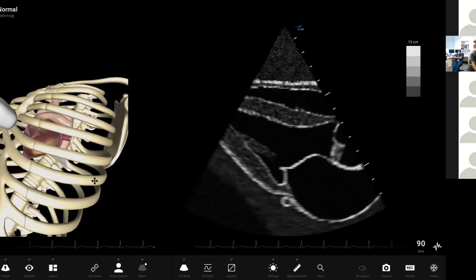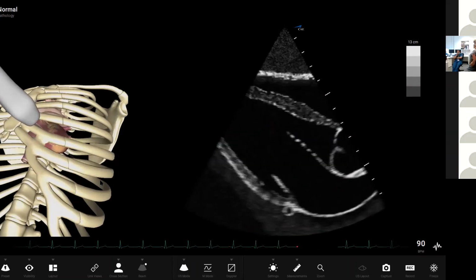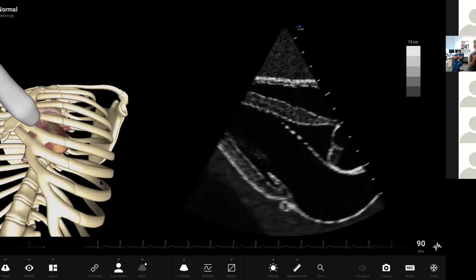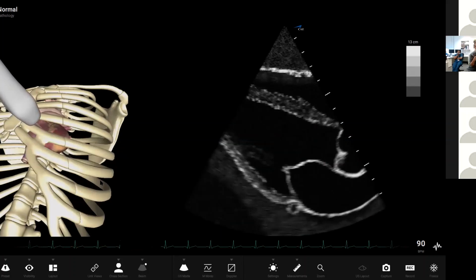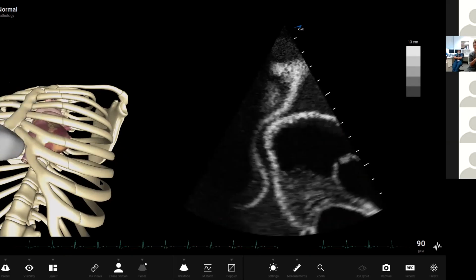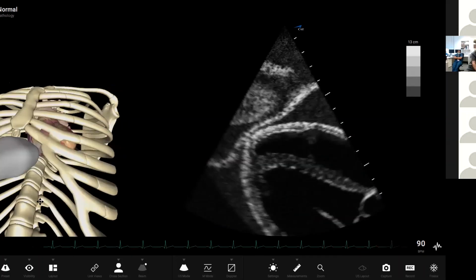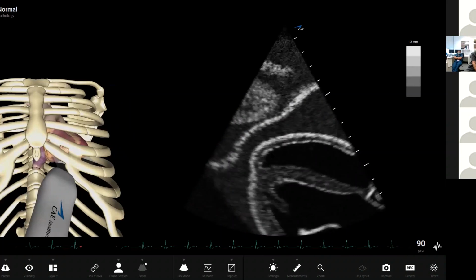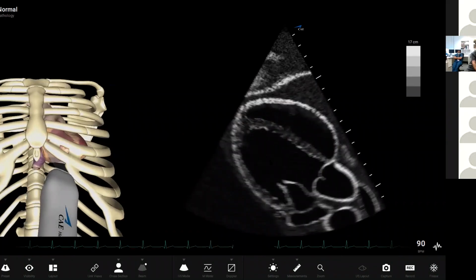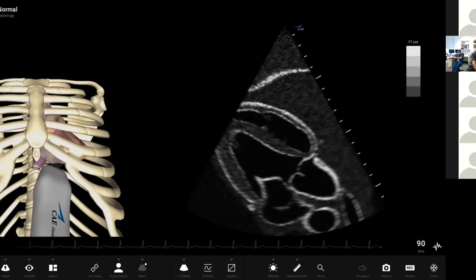I guess one of the things that Faraz talked about a little bit: we started a new lecture series called Reporting with the Legends. I did it with Faraz last week, who's the cardiologist who runs the cardiology echo lab here. He talks about the importance of the parasternal long axis view from the subcostal view. I think that's a really nice place to start from. If you've got someone with difficult to image windows because of whatever, don't forget your ability to get this view here.